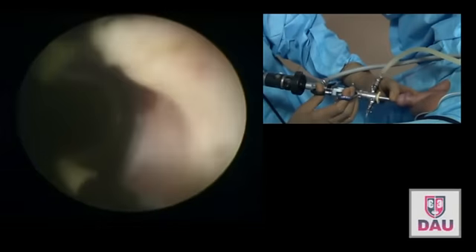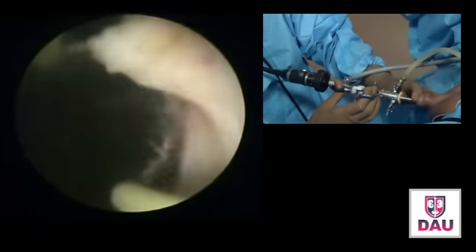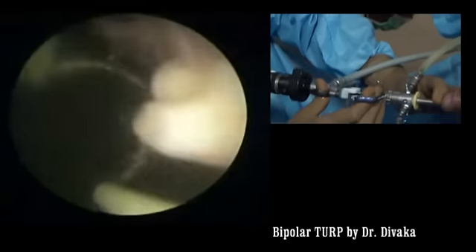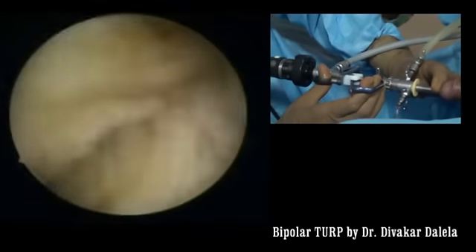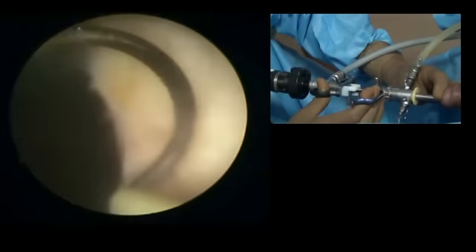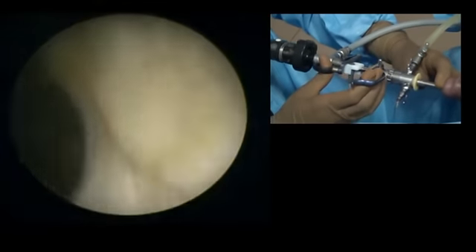You have to check and cut in small chips — the reason being it is a small gland, I can't help it. Large gland or small gland, small chips. Again this is getting deep here. I think we have close to completion of the resection in this patient and we will have a look.